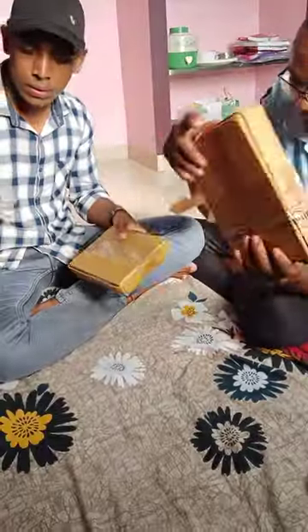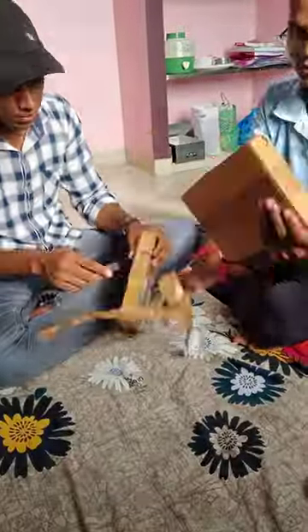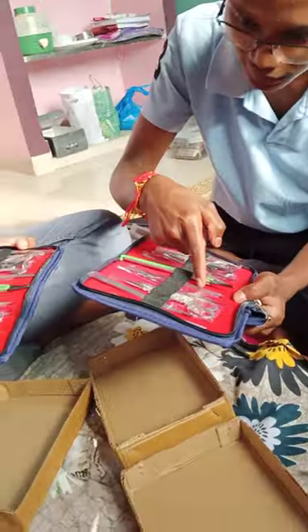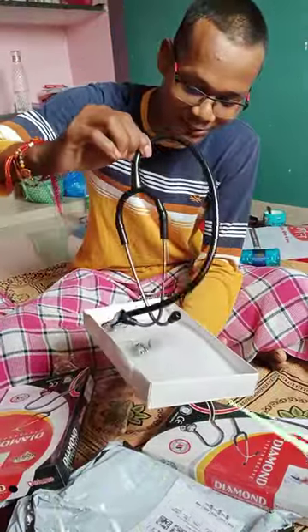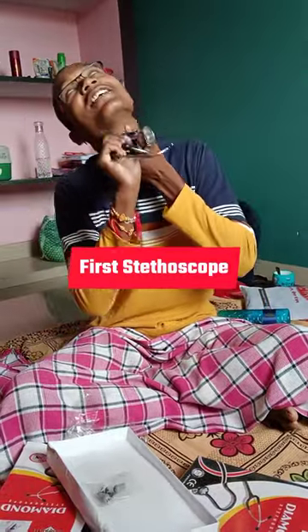Alright guys, we have got a dissection kit. This is not the same. Scalpel, yes, this is it guys. Look at the dissection kit — this is the diamond company. Finally, this is our art. This is it, now we have to use this as well.